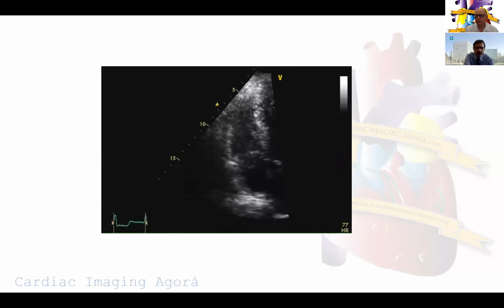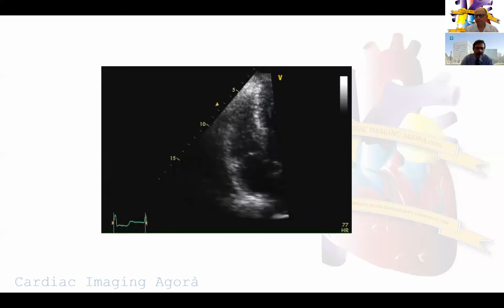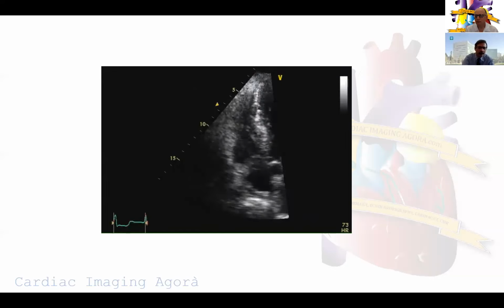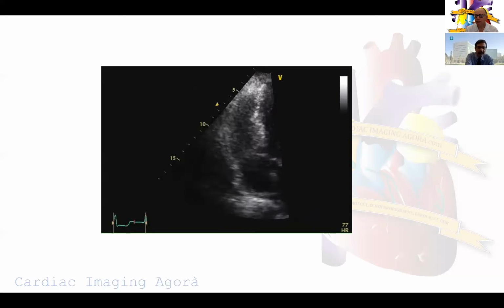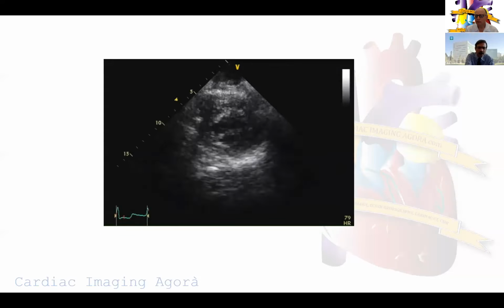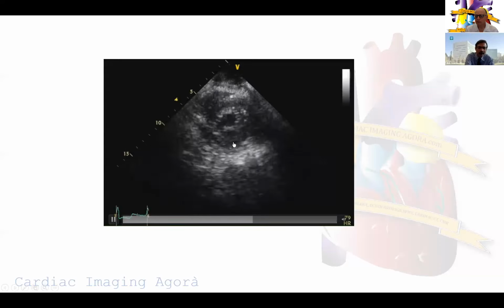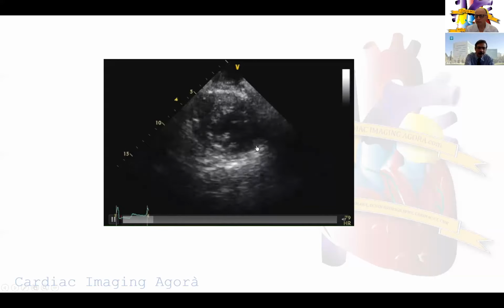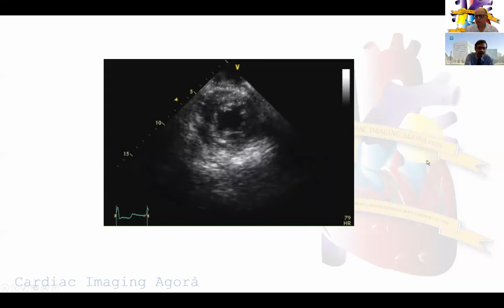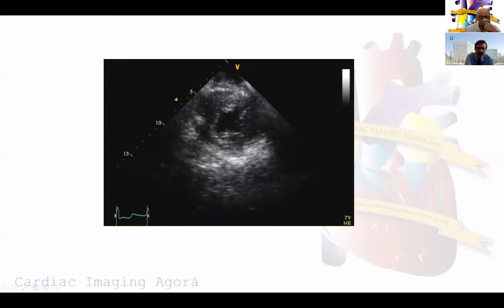So then we focus on the right ventricle here, and you can see that although this is an inferior wall infarction, the right ventricle in size looks pretty good, and the RV function looks very well preserved, and we still don't have an understanding for why our patient is in so much trouble. So we continue with the bedside echo and do a nice short axis view, and you can appreciate on the short axis view a wall motion abnormality between 6 o'clock and 9 o'clock, consistent with what you would think is the inferior wall myocardial infarction we're seeing on the EKG.